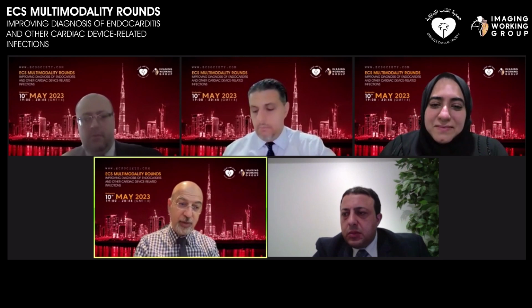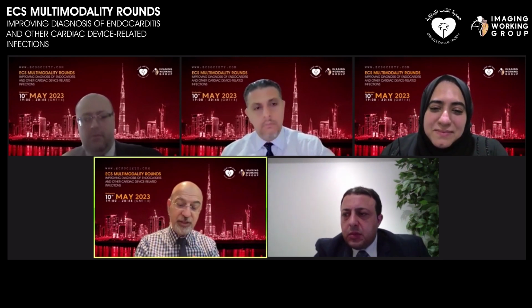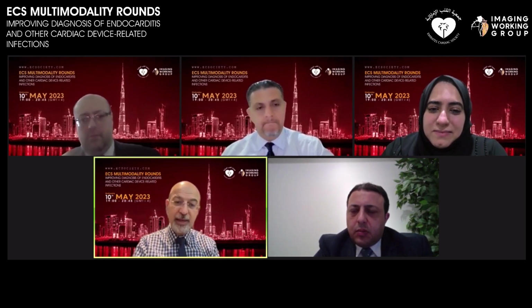Now, as Dr. Mu'adh said, we can sometimes do FDGs, which, however, we have to remember that without pocket infection, the sensitivity of FDG in this kind of lead infection is not as high. I don't know what the sensitivity is, 60% or 80%. It's good, but it's not that great. So for me personally, I just go back and look at the patient as a whole and make a decision. I don't know, Dr. Mu'adh?